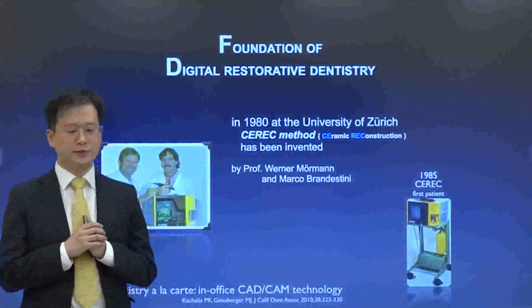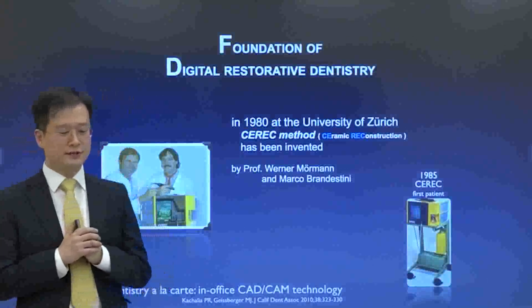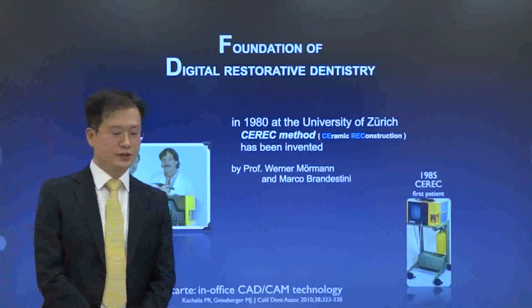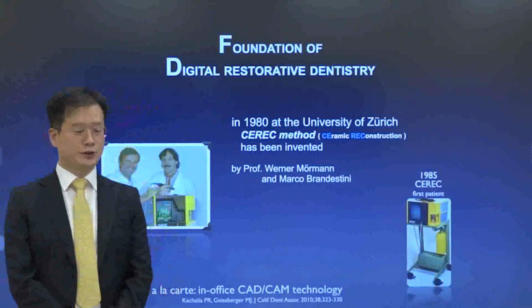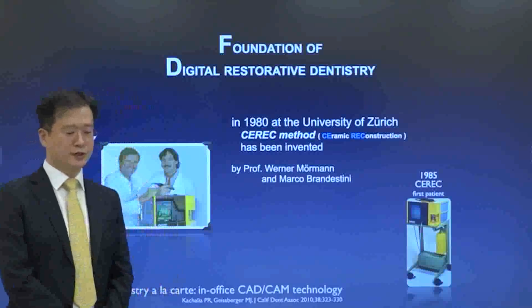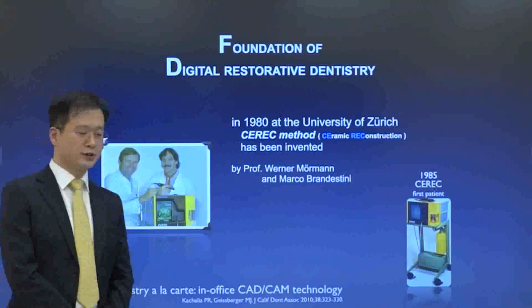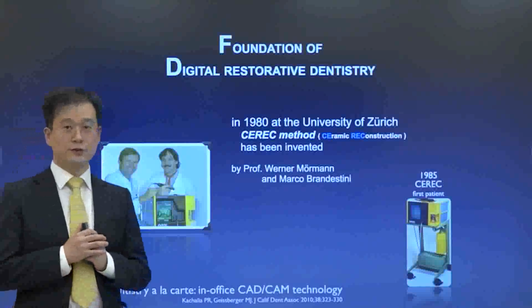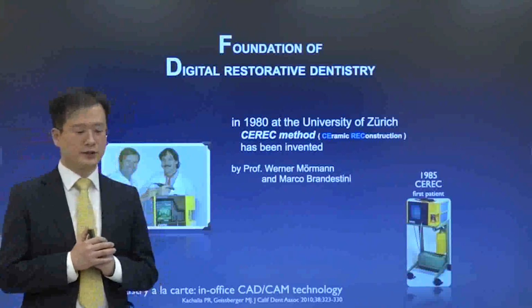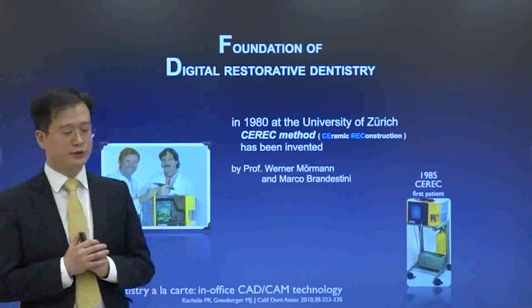Intraoral scanners have been steadily developed since 1985, when the first patient was treated with this device at the University of Zurich, Switzerland. Professor Mörmann at the dental hospital and Brandestini at Polytechnic University introduced the first machine. Digital dentistry has developed over 30 years, and the lack of clinical use is gradually disappearing.